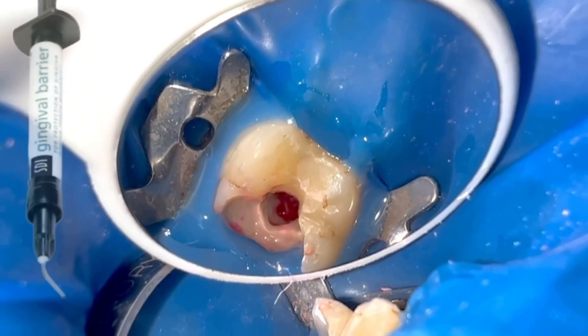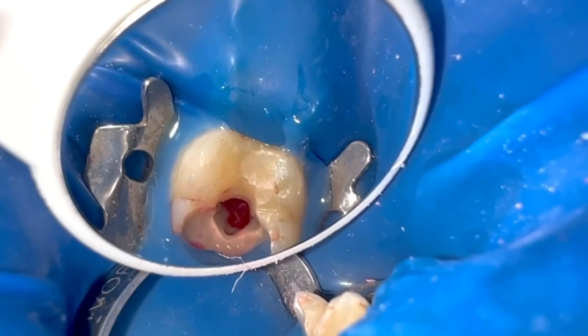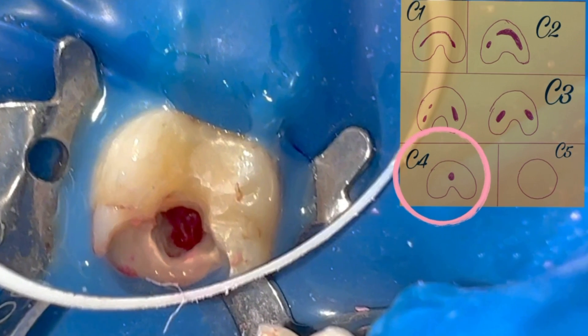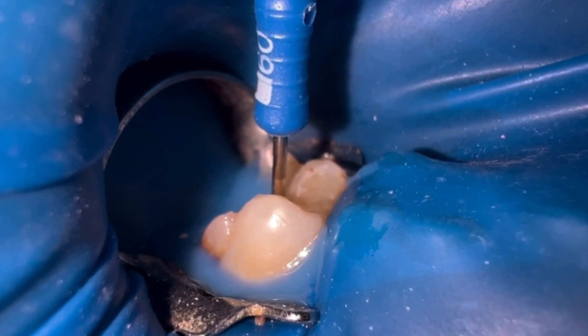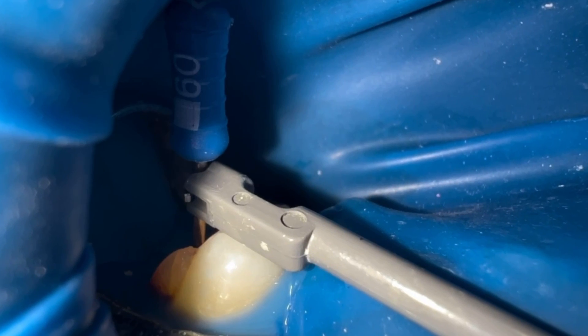C-shaped canal configuration is a variation commonly seen in mandibular second molars. In this case it's a C-4. There's only one round or oval canal. We found a very large oval canal where we achieved an apical stop with a 60 file.